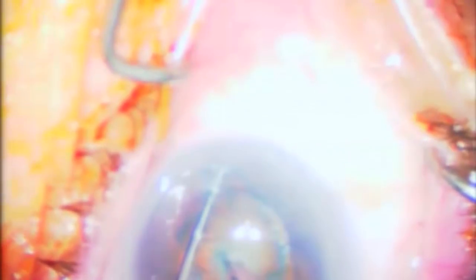Here we show the phaco tip removing the anterior epinucleus, and once this is done in the area of the capsulorhexis — which is stained here — I will make a little tunnel on sculpt. You can see the lens milk coming out. I'll go all the way in until the phaco tip is buried all the way to the sleeve, and then ask the assistant for the chopper. This is a dotted horizontal chopper. I'll place it out underneath the rhexis, and then chop.